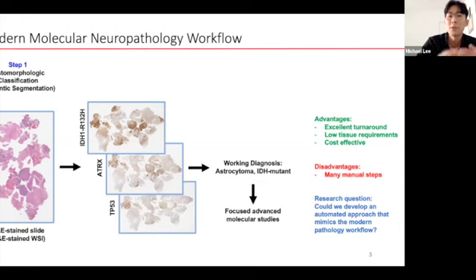I came up with 4 major steps that mimic the modern pathology workflow. The first major step we called histomorphologic classification. As the name suggests, and as pathologists work, you would first have AI tools examine the morphology and histology of these cells under the microscope, in the form of digital whole slide images. The second major step is biomarker quantification. These immunohistochemistry stained whole slide images can be quantified and analyzed by a different set of computational tools.